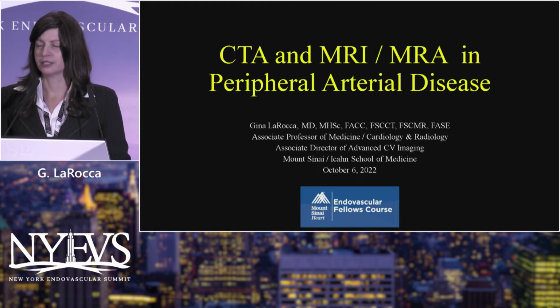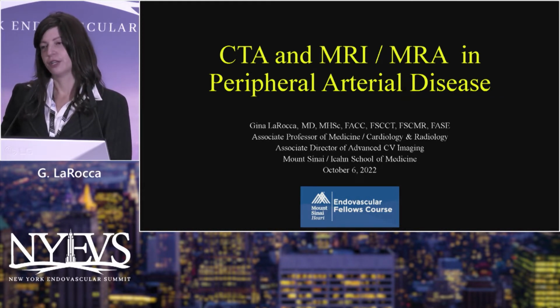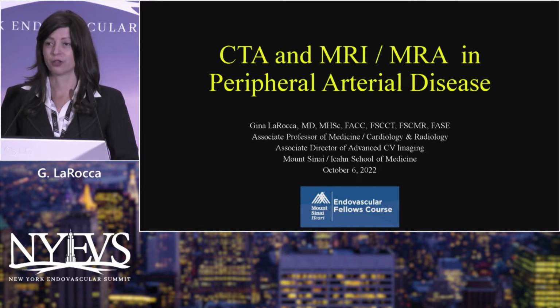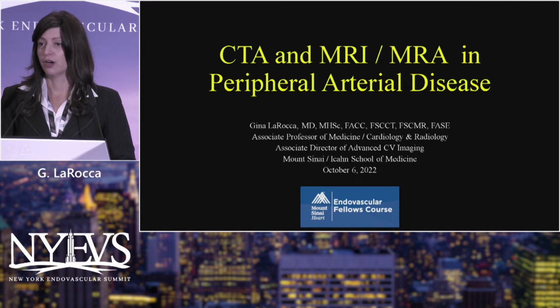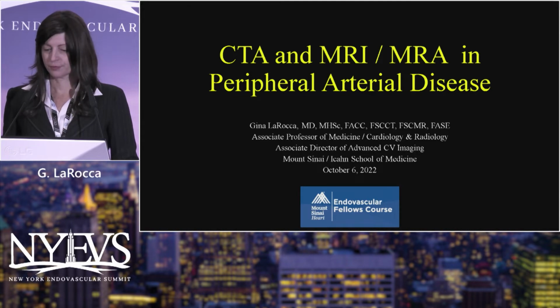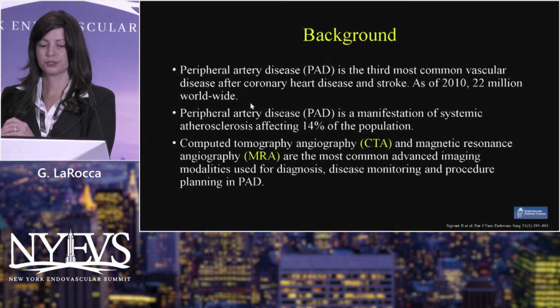I'm hoping to give an overview of CT and MRI in peripheral vascular disease. I teach a lot of the vascular fellows, and so I might be diverting off the path a little bit to what we do at Mount Sinai and what you'll be learning if you sit next to me and start reading CT and MRI on our vascular patients. I have no disclosures.